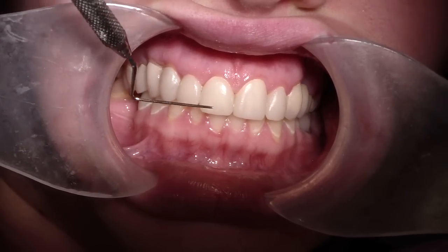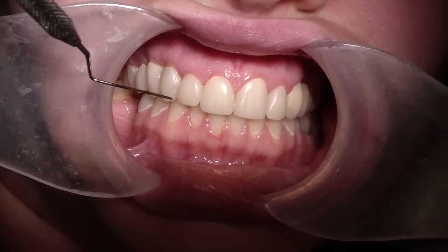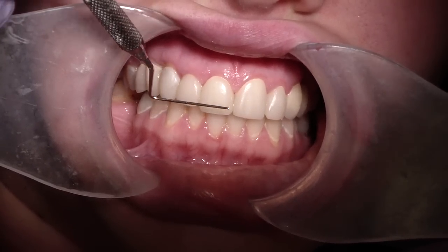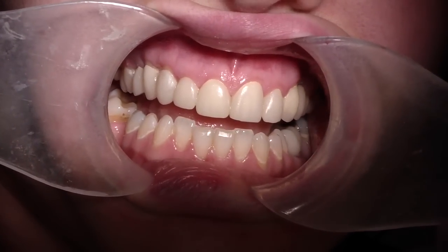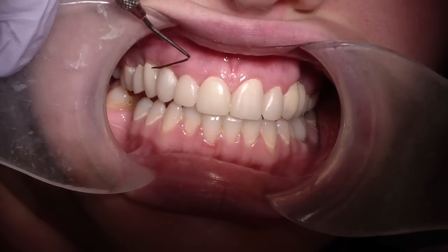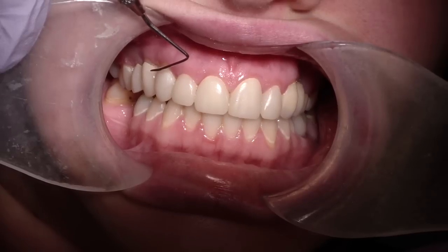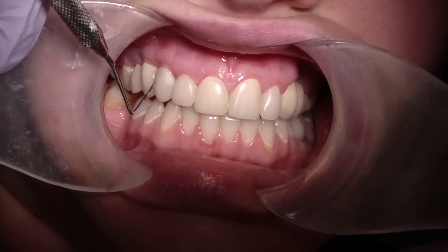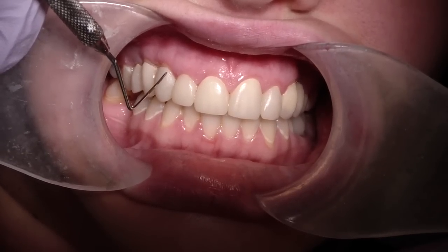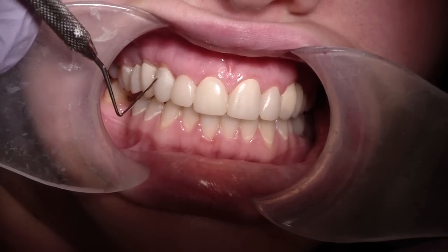This is patient SA — either way it works. We've now finished our provisionals and we're about to take our final impression. One of the things we did is we forced erupted, or extruded, this canine — tooth number six or number thirteen. Once we extruded it, it needed to gain a little more tooth structure, so we did crown lengthening, but we lost the papilla in the crown lengthening procedure.